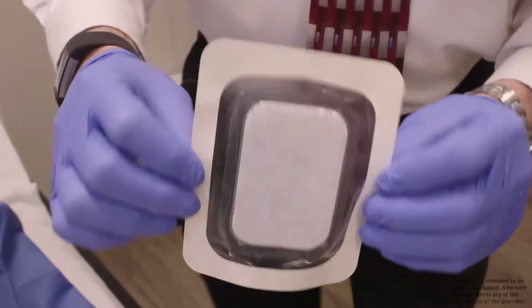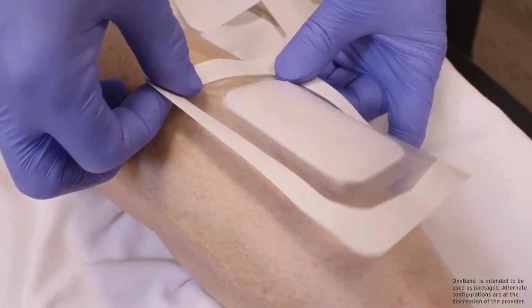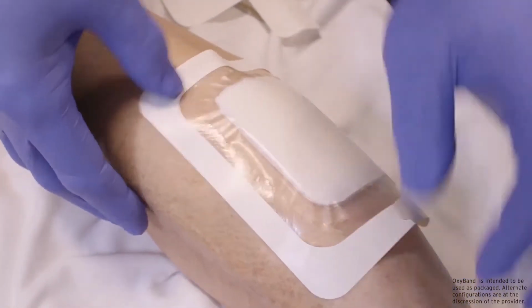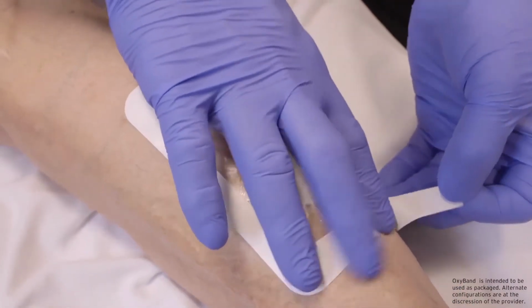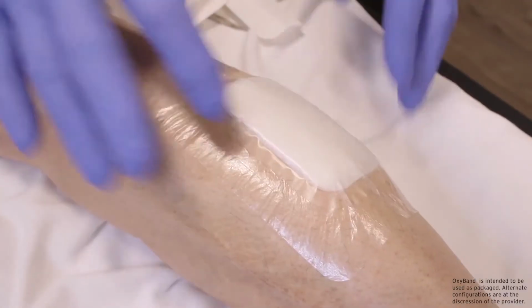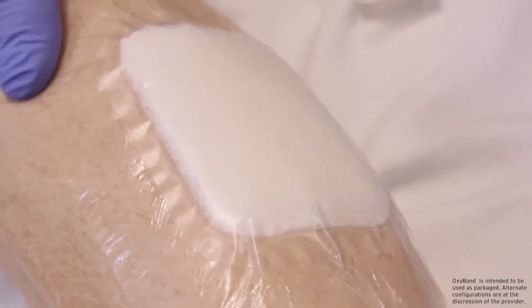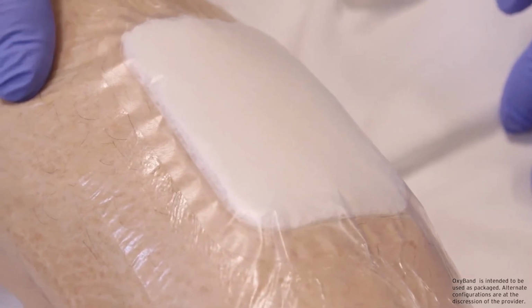The adherent side has been opened. We're going to cover that wound with the portals that allow the oxygen to diffuse into the wound, and we're going to secure the dressing in all directions with gentle pressure. And we want to achieve a seal all the way around the wound, as we're doing here. Remove the protective application borders. We've created an envelope around the wound now. As you see, the oxygen in the reservoir is being delivered through that semi-permeable membrane and those small holes you saw on the flip side. That oxygen can penetrate to the wound. It'll go through the foam into the wound base and deliver oxygen over a 5-day period.